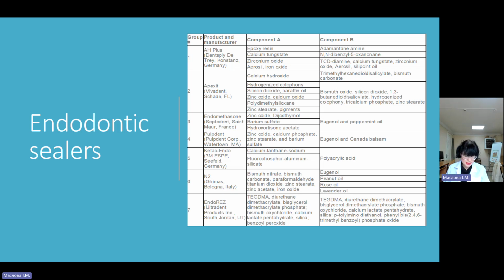Calcium hydroxide sealers. Calcium hydroxide sealers were initially developed to take advantage of the antimicrobial properties of calcium hydroxide, with the idea that they would display bioactive potential. However, they have not shown bioactivity. For example, CRCS, Apexit, and Apexit Plus are popular available versions.